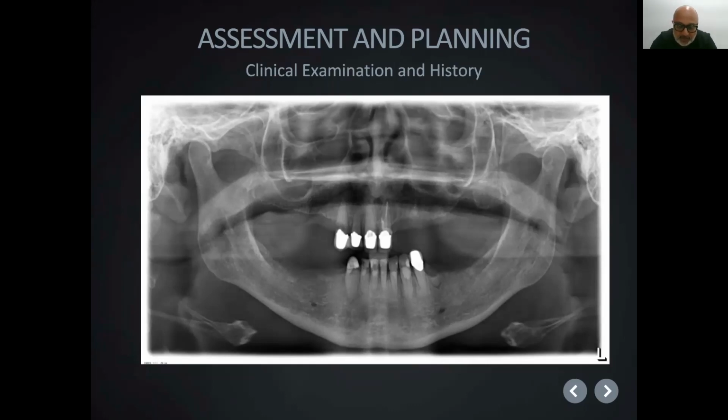Respectively to the teeth, it doesn't look as if it's as bad as the top, but it is, because the lower teeth are foreshortened and have been worn down and heavily restored. We knew that restoring this would involve prostheses that were exceptionally long, and not really what we wanted restoratively. So we knew that we would be using some pink gum to do this.